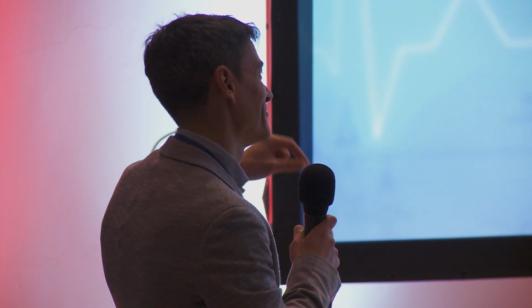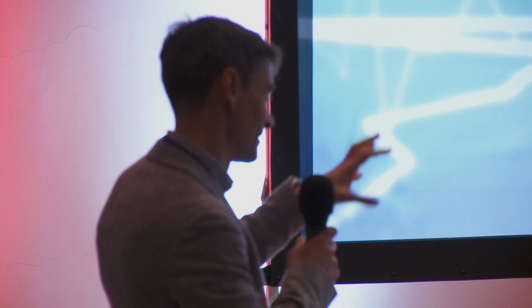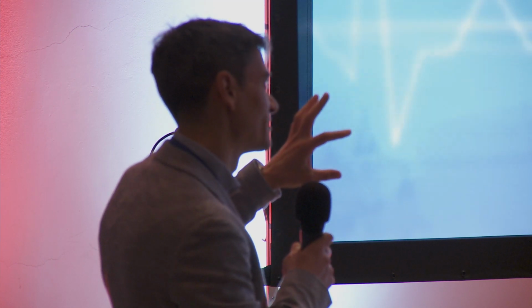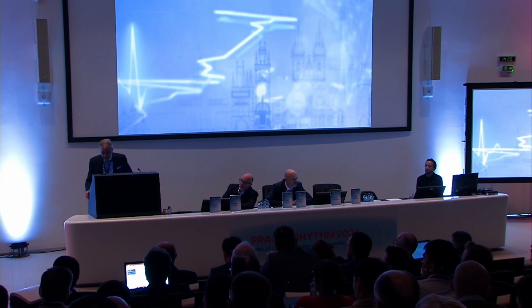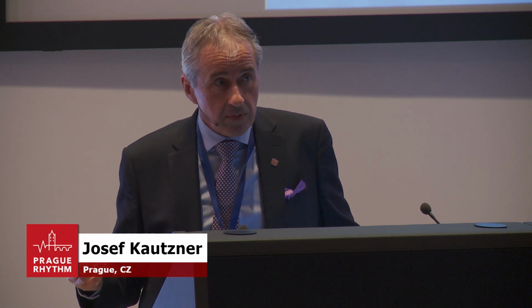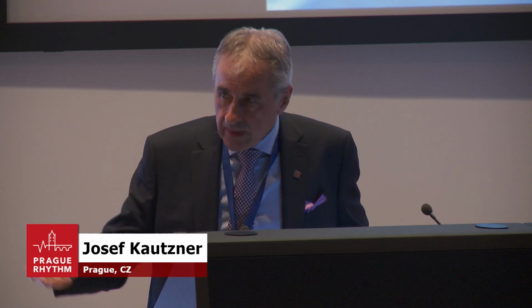And I have one specific question regarding the prevention of steam pops. When you were in our lab teaching us VT ablation, I remember you used like 30 watts, 40 watts maximum, not more. What are your settings now? We are not very far from it, because you can now use QDOT or Diamond Temp with 50 watts, and it seems to be very safe, preventing steam pops. But if you use a conventional catheter, you often have steam pops with 30 or 35 watts, depending on the location, the flow around, etc.